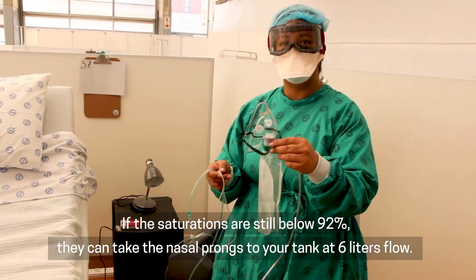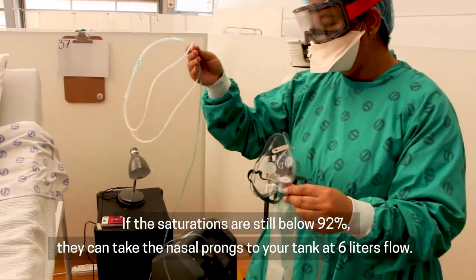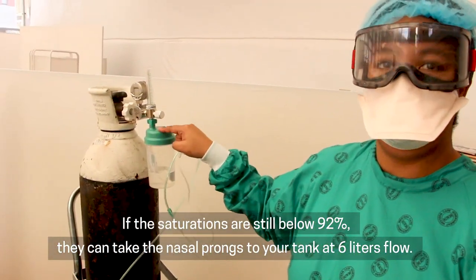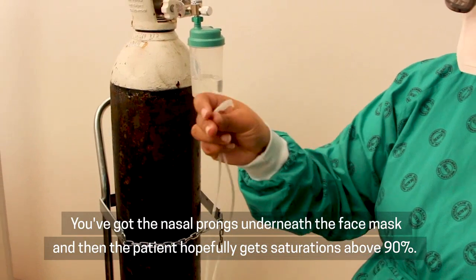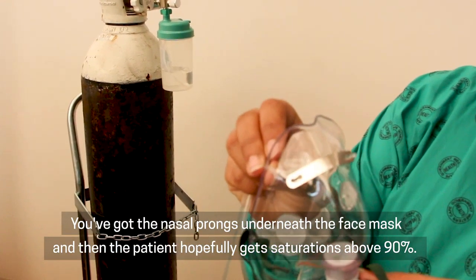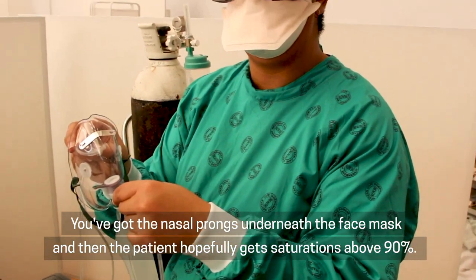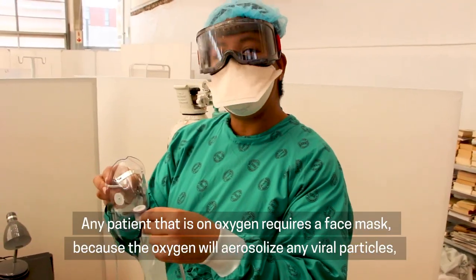If the saturations are still below 92%, you can take the nasal prongs to your tank at 6 litres flow. You've got the nasal prongs underneath the face mask, and then the patient hopefully gets saturations above 90%.